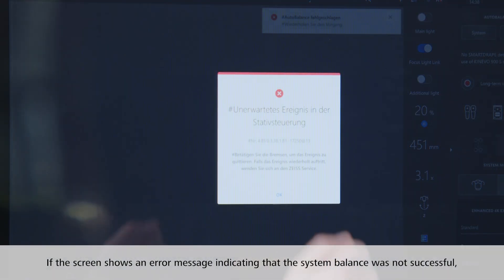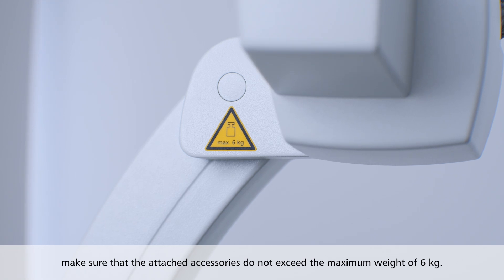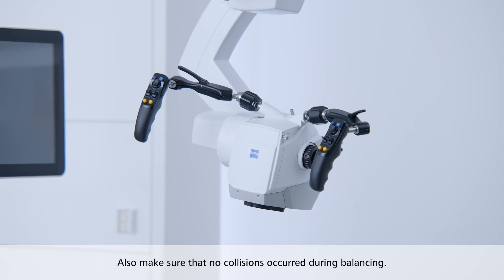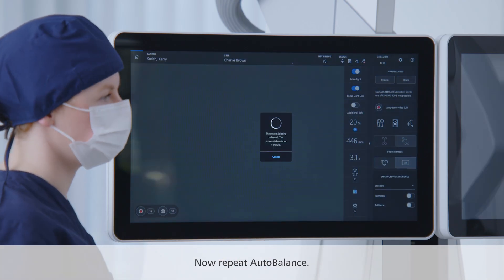If the screen shows an error message indicating that the system balance was not successful, make sure that the attached accessories do not exceed the maximum weight of 6 kg. Also make sure that no collisions occurred during balancing, then repeat Auto-Balance.